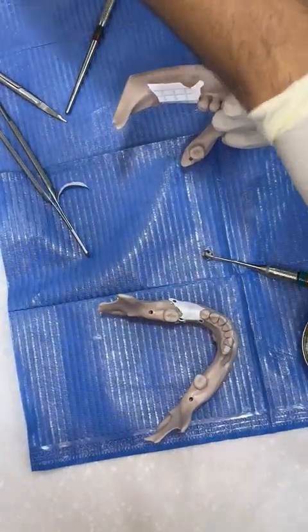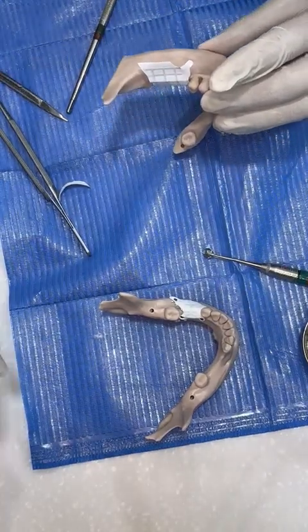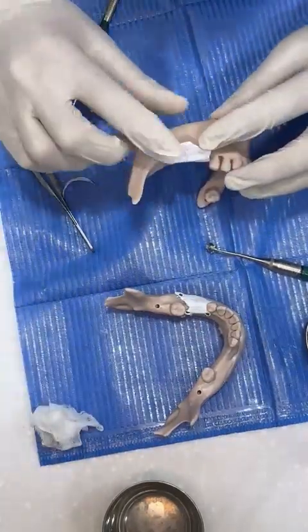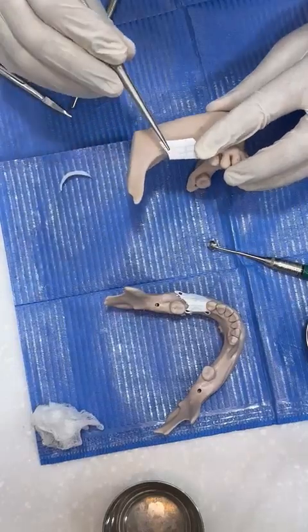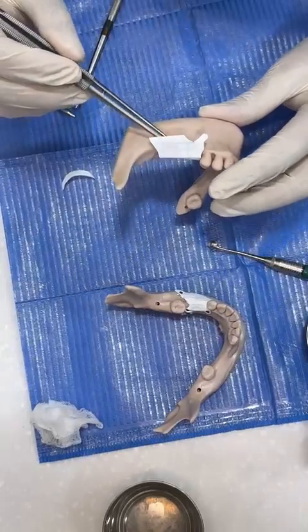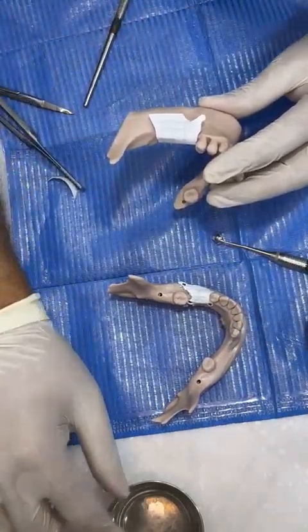Remove the seal. Yes. And you can add some saline from here. Okay, now I check the adaptation of the membrane. Okay, we need more graft before we can fix the last screw. Yeah, put all please. Put some saline.